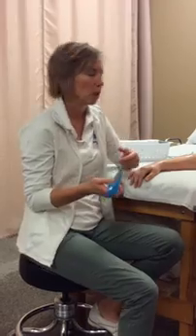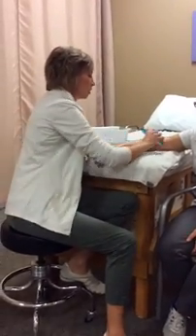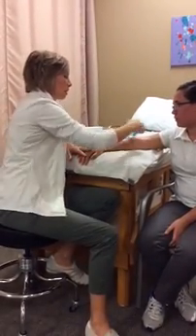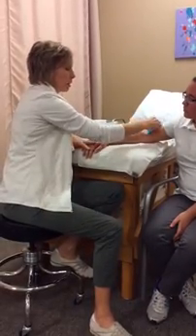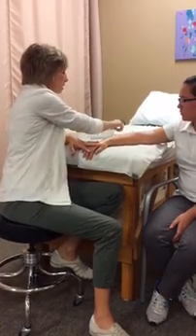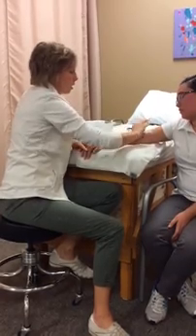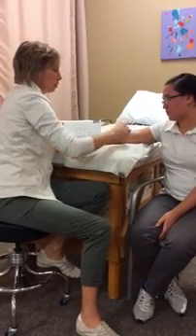So once we've identified where the problem area is, my practice patient here now is Wincy, and with her, as I'm going along here, we'll often see this for people that have what we call tennis elbow. And oftentimes what we'll find is the tight area is this small muscle that attaches right to the elbow. So in her case, after I find that area that's tight, I can feel a little bit of the bumps there.